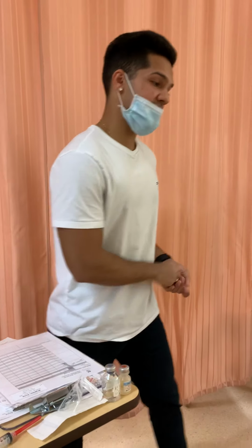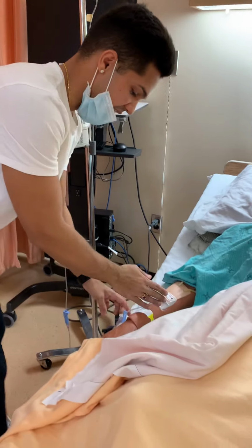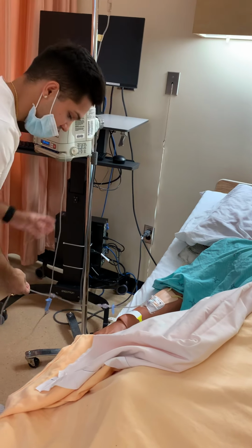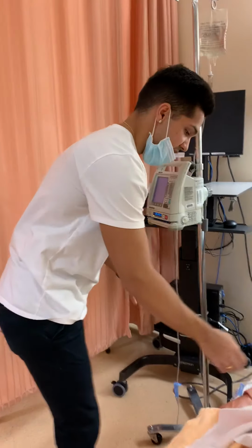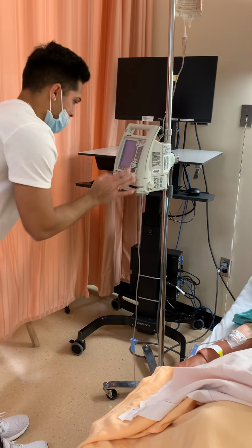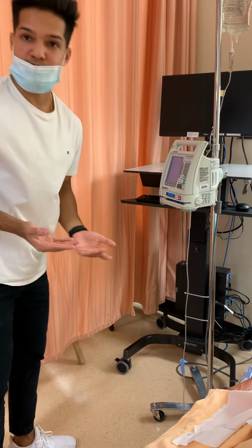Okay, so now first thing we're doing is assessing the IV site. I'm going to be assessing the IV site, make sure there's no phlebitis or erythema on the IV site. There's no kinks in the tubing, there's no bubbles. Everything seems to be infusing perfectly. Patient's not complaining of any pain, and there's no signs of infection. I'm looking at my pump. My primary is running at 25 milliliters an hour right now, which is an appropriate rate.